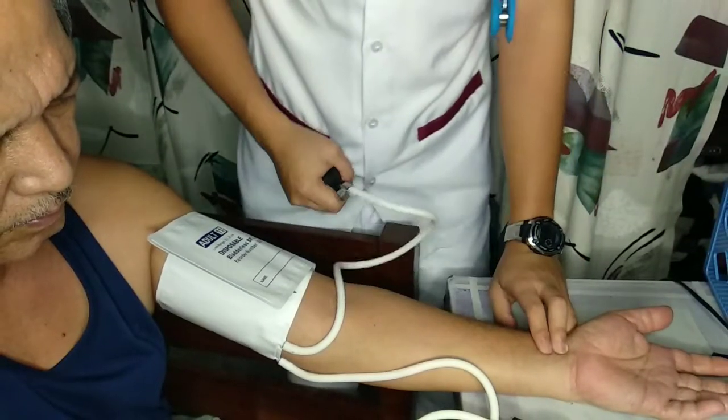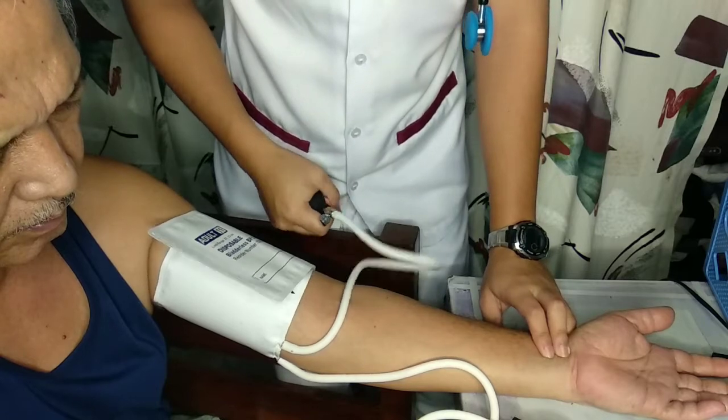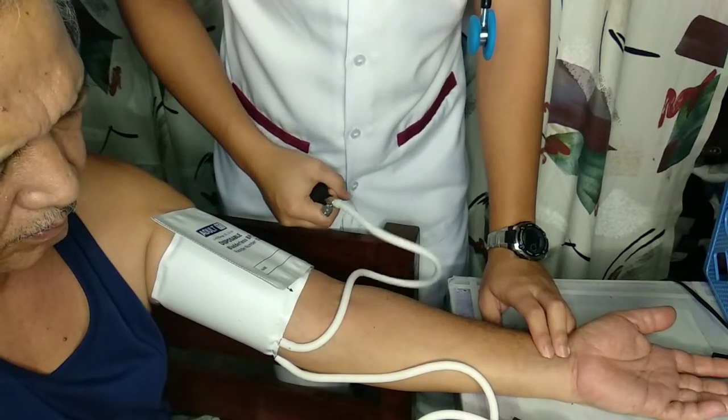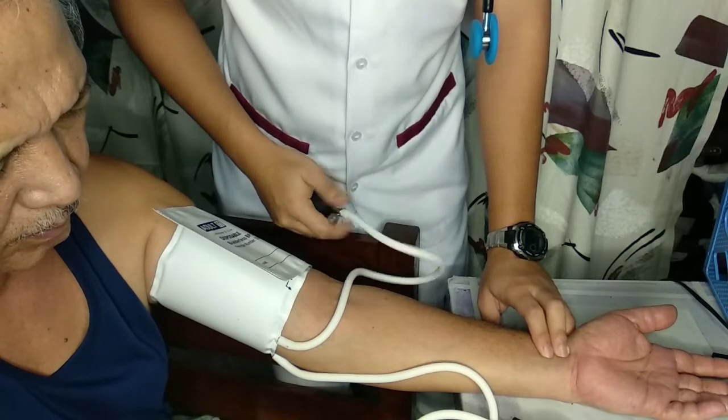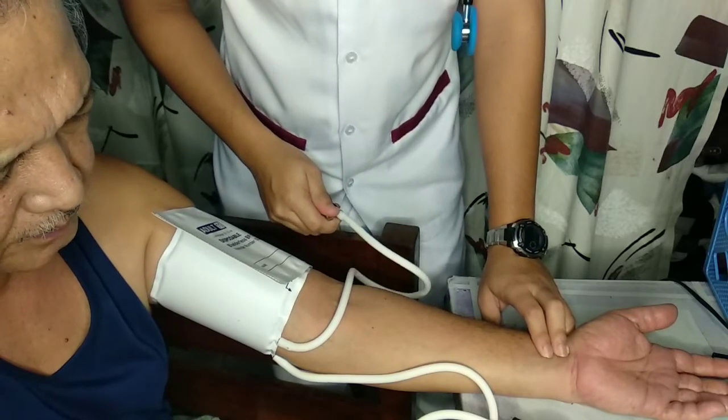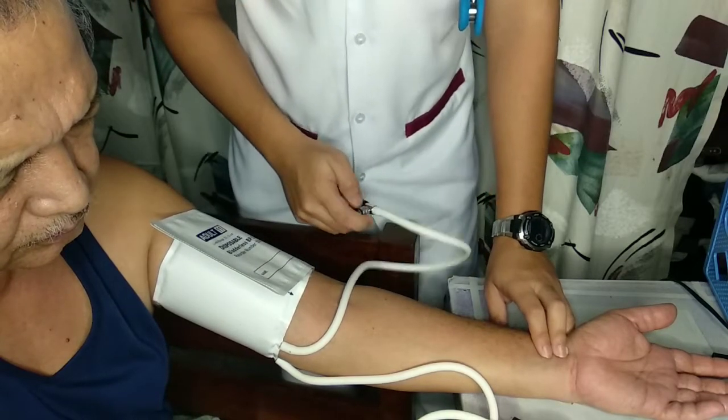So let's estimate the systolic blood pressure. You need to palpate the radial pulse and inflate the cuff until you can feel no more pulse. So the estimation is 120. Deflate it and wait for 15 to 30 seconds.